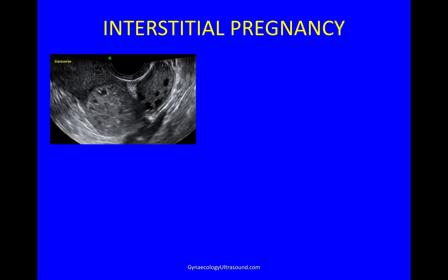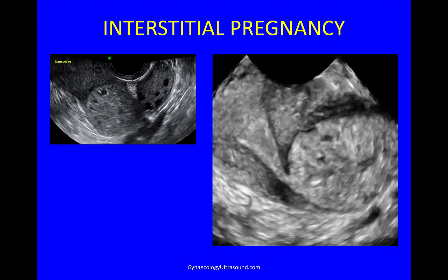In interstitial pregnancy the 3D view is very important. In this case there is a transverse view of the uterus and ovary, with a pregnancy in this position — whether it is tubal or interstitial is difficult to determine on 2D. But on 3D, with the endometrial cavity visible at one edge, you can clearly see this is just the beginning of the interstitial portion of the fallopian tube, and that is exactly where the pregnancy is located. It is so important to be able to make that diagnosis.